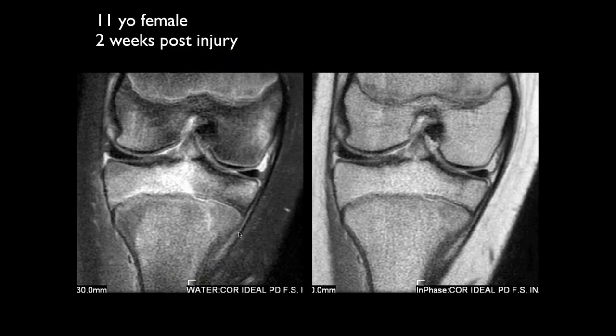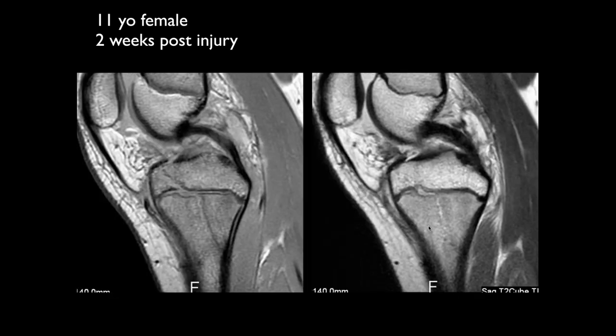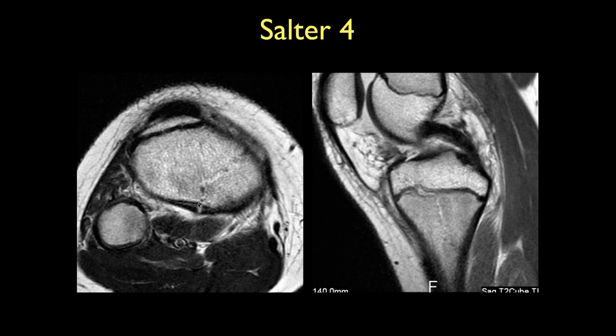Here's an 11-year-old female, two weeks post-injury, with a lot of bone edema. Further images show the fracture going through the growth plate into the metaphysis — this is a Salter-Harris 4.